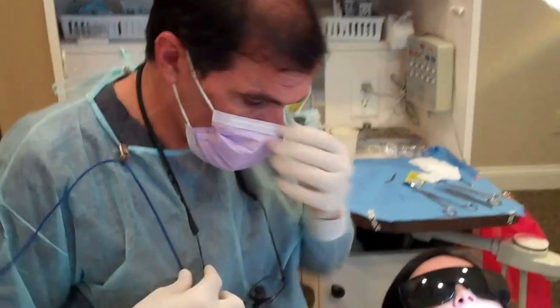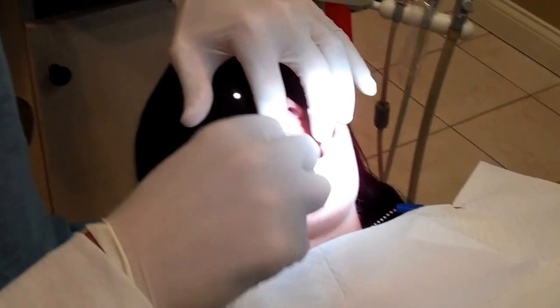She's got some recession on number 6 that we're going to treat today. So I just want to show you how we measured for her attachment level and give you a little better idea, because it's really something that we haven't been taught that well, so maybe this will help clarify some things. So come take a look and I'll show you exactly what we're going to do and how we measure this to determine what we should do in this area.